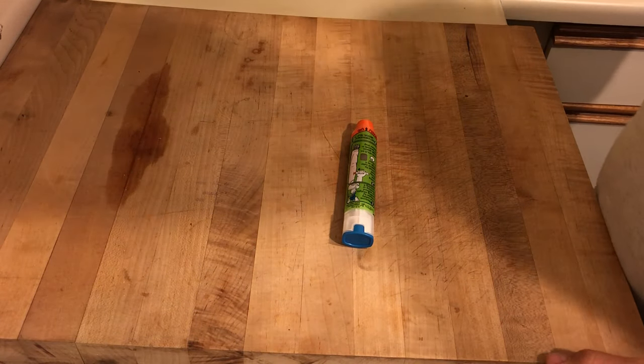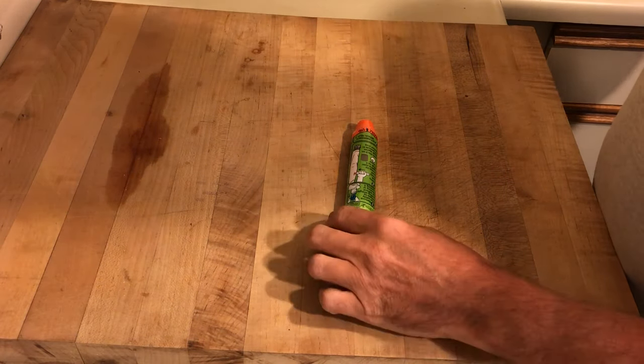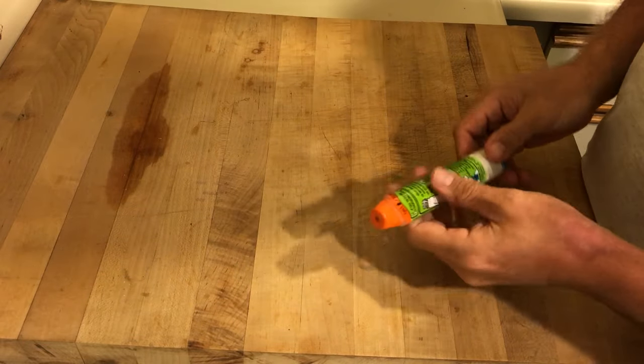Today we'll be learning how to get the extra doses out of an EpiPen. The first thing we'll do is give the EpiPen to the patient.